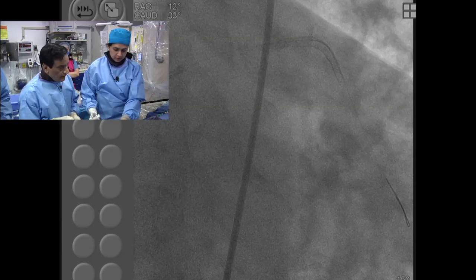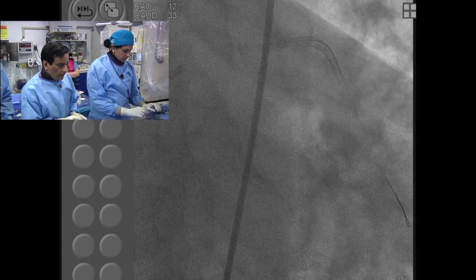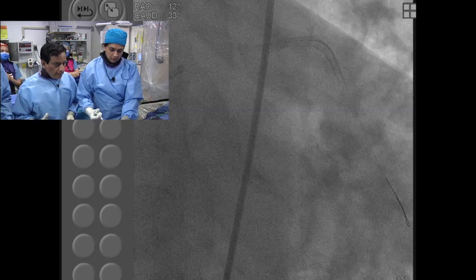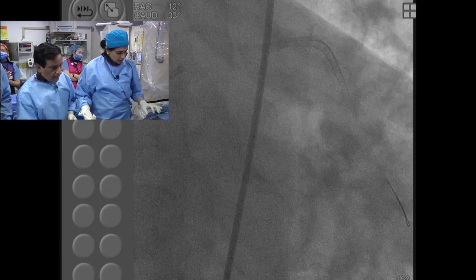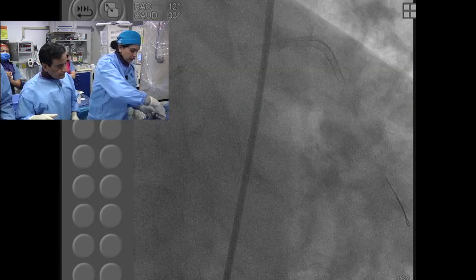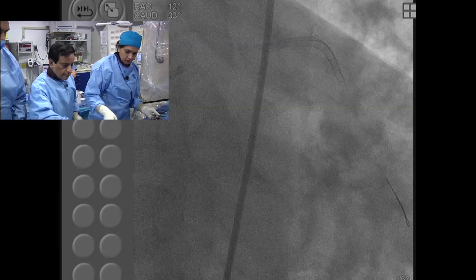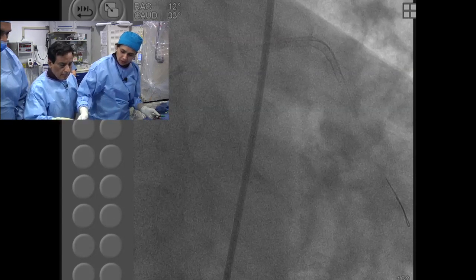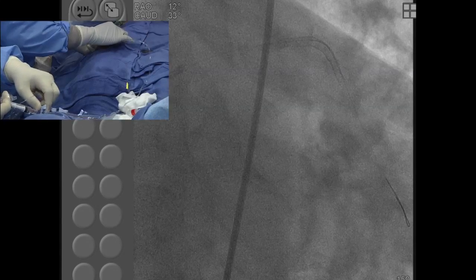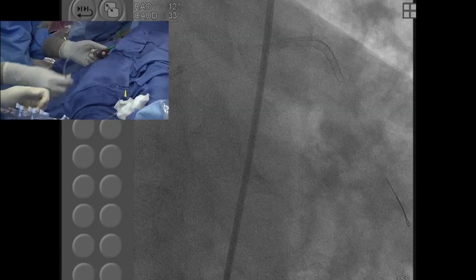Want to take the wire, push it out a little bit. And always have to be careful when you remove your device with the air, because many times issues could happen. There is some air trapped in the system. Let's disconnect here. Go forward. Okay, keep going forward. Increase the flush. You go also forward from here, inject. Yeah, keep going. One second, you took air. Okay, go forward.